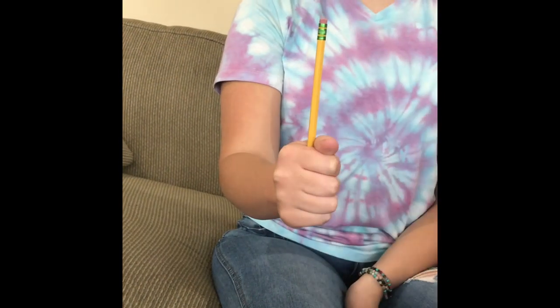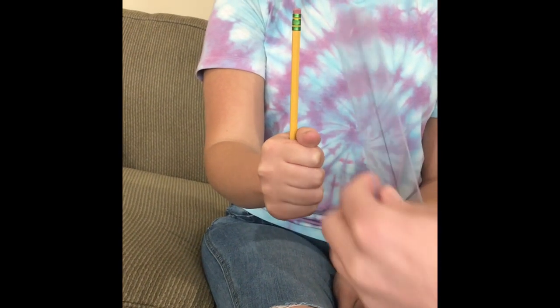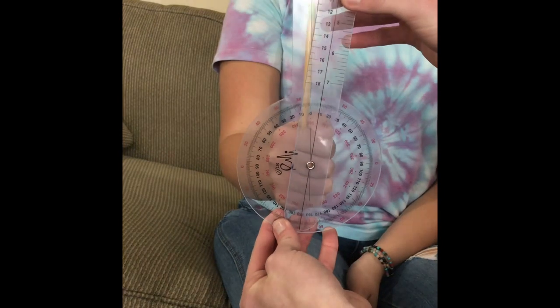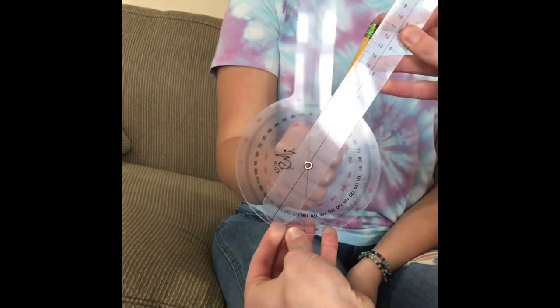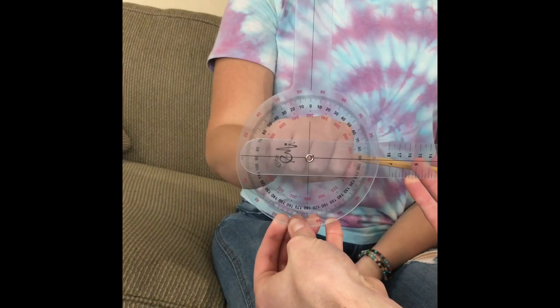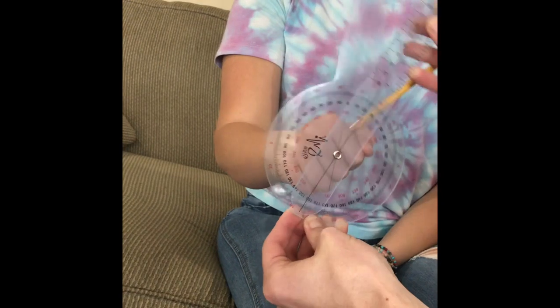All right, now we're going to be measuring wrist pronation and supination. In order to accomplish this, you have your patient place a straight object in their hand to use as the movement arm, and your stationary arm will be your perfect vertical. And then you'll have your patient move into pronation, like so. Make sure the axis of rotation is equal with the wrist, move as far as they can. And that's at about 100 degrees of rotation there. And go back to center.